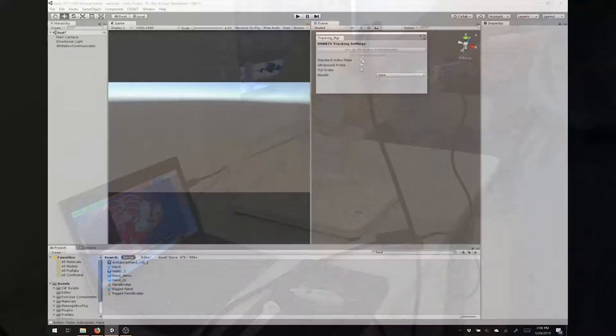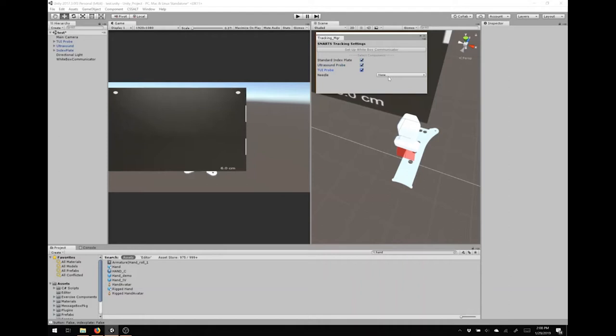To facilitate software development, a software development kit was made to be easily integrated with the modular stand and a set of handheld tracked tools, such as a needle and ultrasound probe. This kit is a code library developed in the Unity game engine and consists of features that facilitate developing procedural simulations.